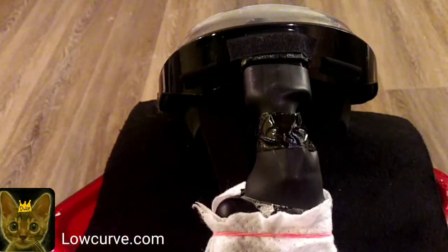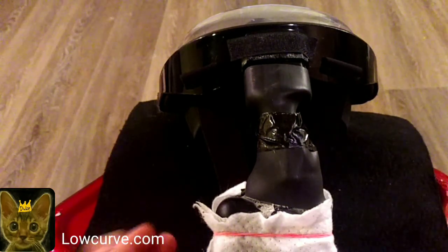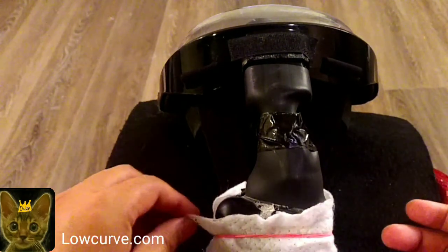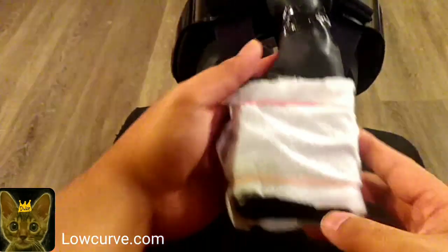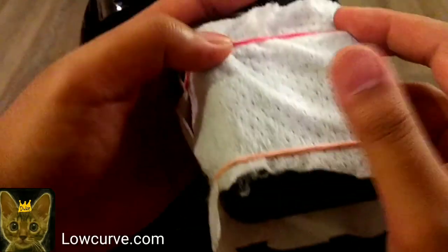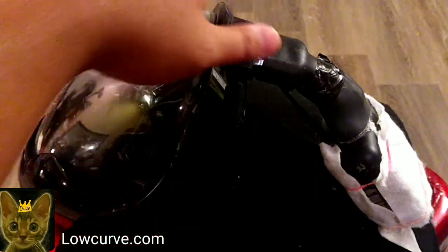So when you're having your input module, obviously you need to filter the air, right? So all this is filter material. You can get any type of filter material. Some people use furnace filters. There's a variety of different ones on the market. But all I did is I wrapped it around all sides because you're not sure if there's air coming in through any here, and I used a rubber band to secure it down on both ends. Okay, so now you have an easy way to replace the filter, and that's pretty much it.